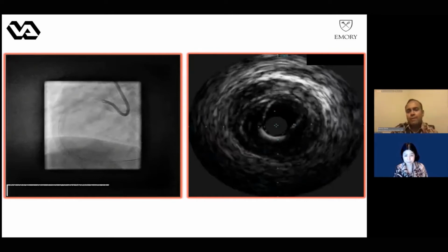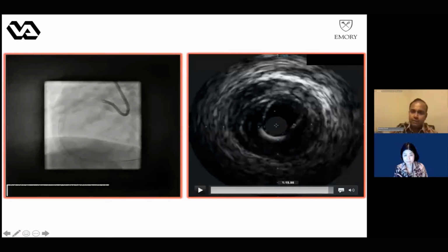So we have had some experience with this phenomenon. I have seen a similar appearance with orbital atherectomy, where I once had a perforation that had very similar behavior. And we have seen a few of these with intravascular lithoplasty as well. So we are seeing this with IVL. I figured this is something interesting that the panel and the audience might want to know. Any comments from the panel as well?